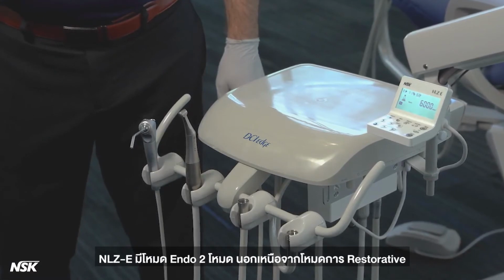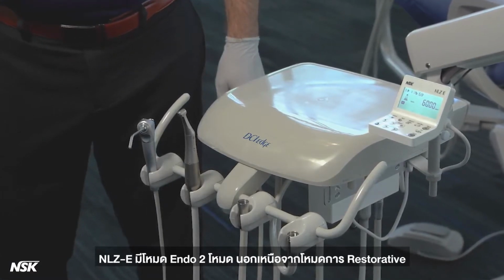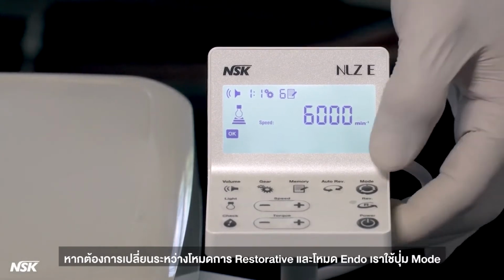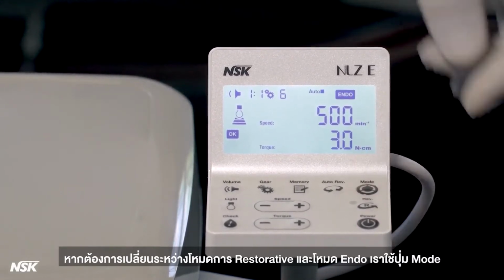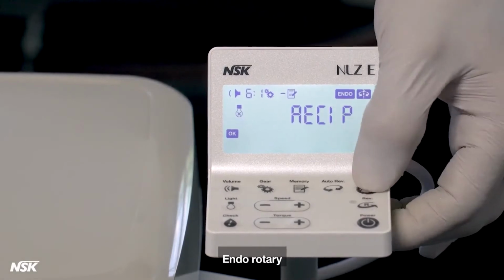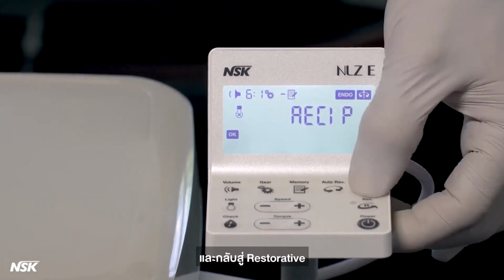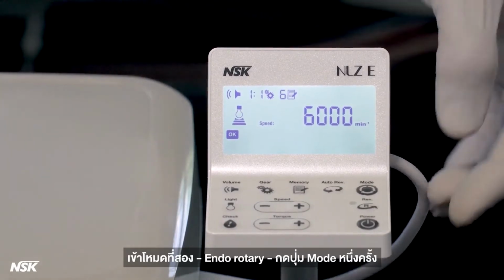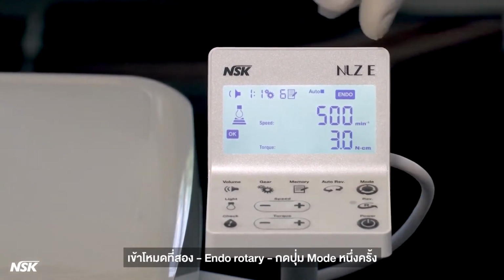The NLZ E has 2 Endo modes in addition to the Restorative mode. To change between Restorative and Endo modes, we use the Mode button on the top right corner of the touch panel. Endo Rotary, WaveOne, and back to Restorative. To go to the second mode, Endo Rotary, press the Mode button once.